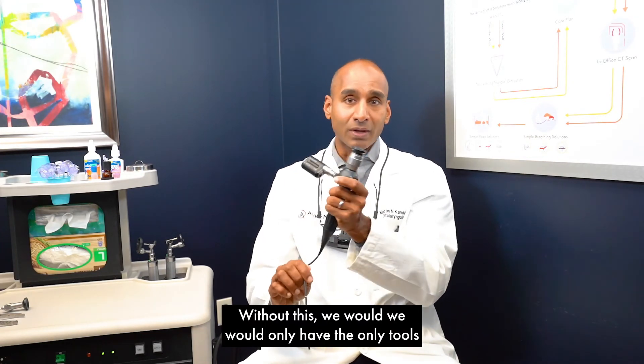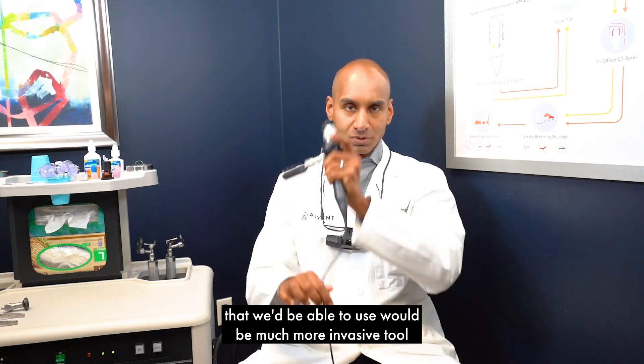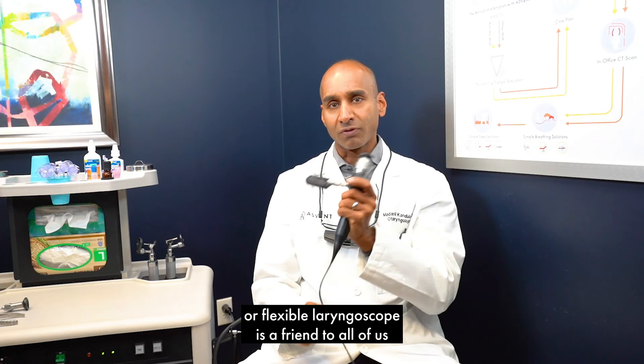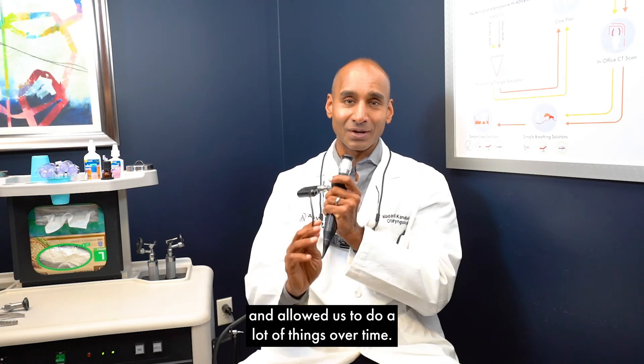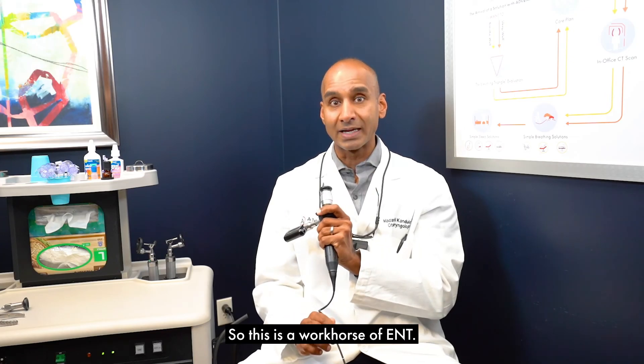Without this tool, we'd only have much more invasive instruments available. The flexible endoscope, or flexible laryngoscope, is a friend to all of us and has allowed us to do a lot of things over time. It truly is a workhorse of ENT.